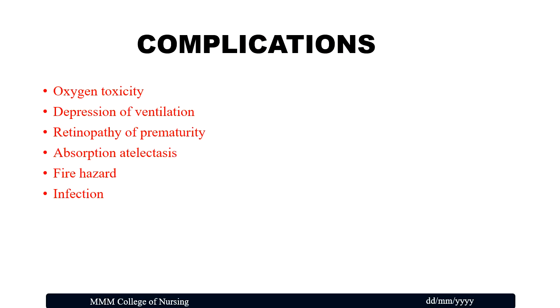What are the complications? Maintain hygiene as I told you earlier. Now we'll see the complications. Oxygen toxicity, depression of ventilation, retinopathy, absorption atelectasis, fire hazard and infection are the complications.